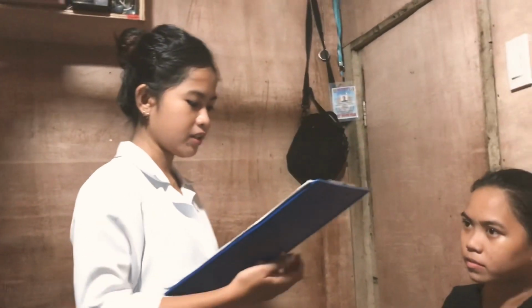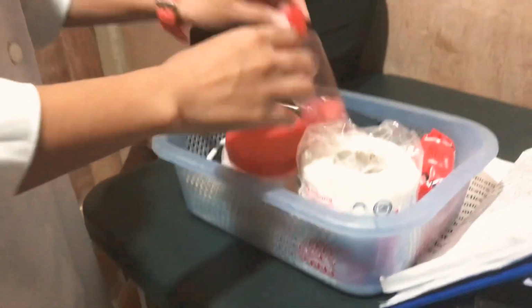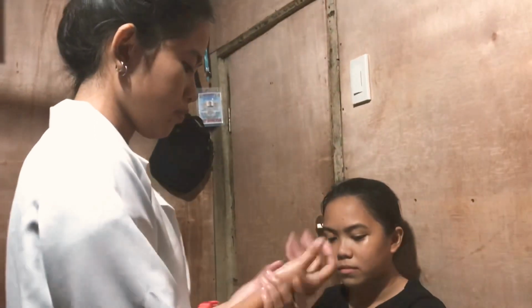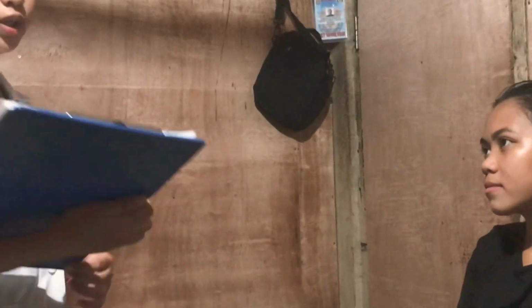Ma'am, your respiratory rate is 15 and your radial pulse is 78. And lastly, ma'am, I will take your blood pressure.